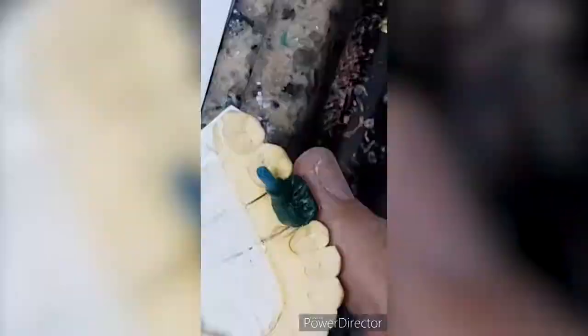Placement of the investing ring before pouring the investment material is crucial. A special type of gypsum is poured slowly.